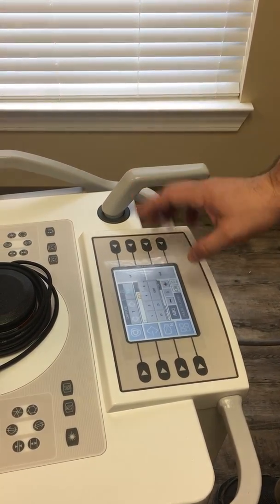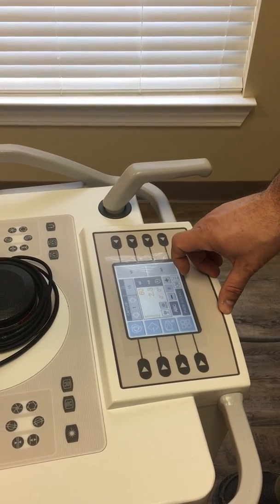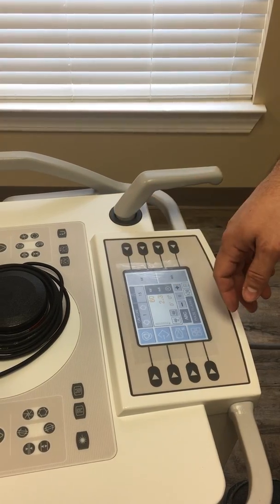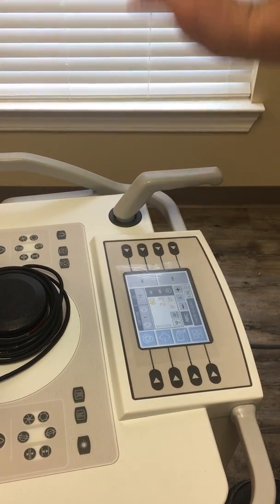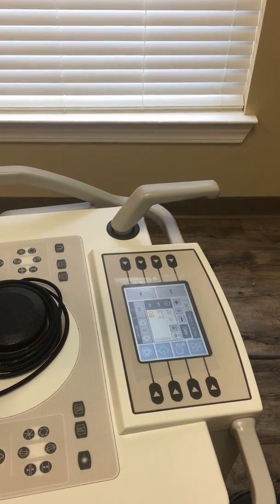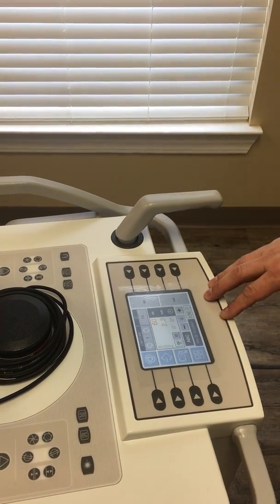And if so, the mode works just like normal fluoro, but it uses a pulse, and you can just change that pulse. But you could just leave it at 15 and shoot with it. If he likes the images he's getting, you just say, okay, great, we achieved a lower dose, everything's fine.